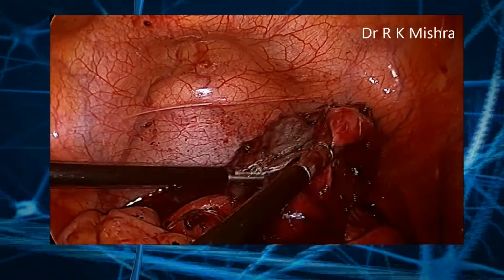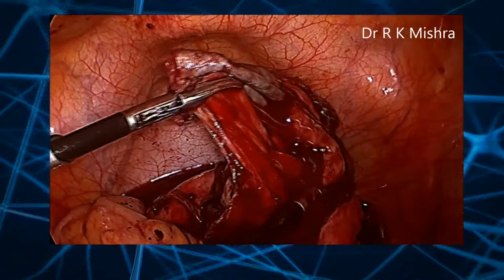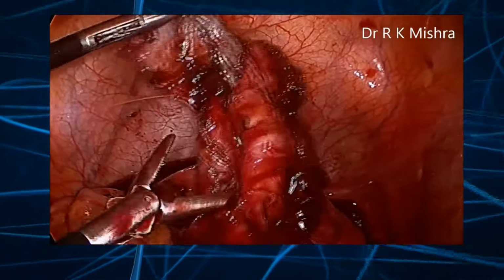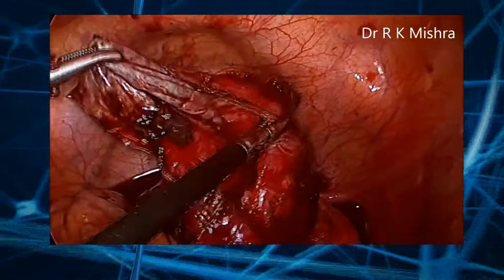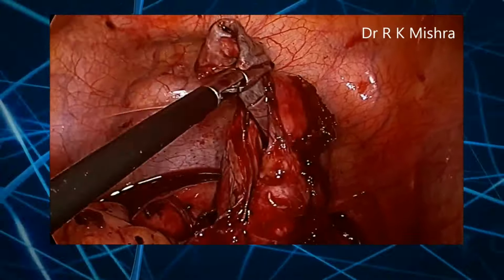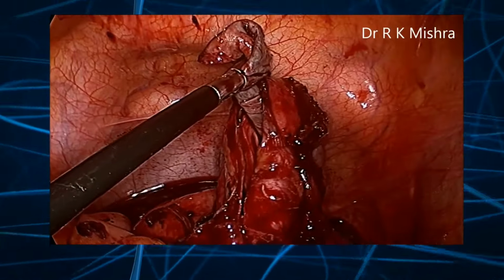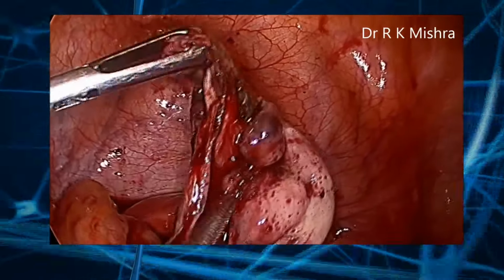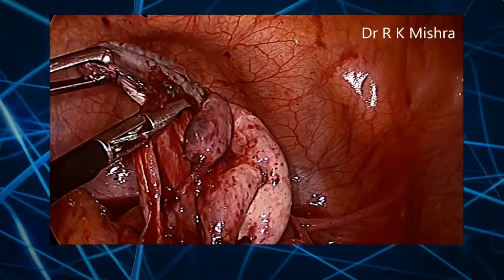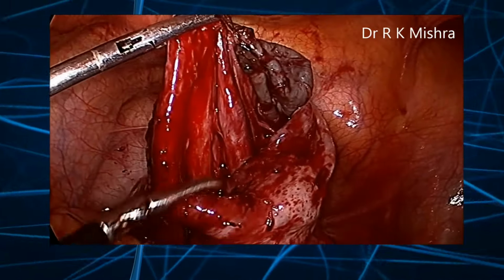This is coming out. This is again inner cystic layer. And you can separate it.